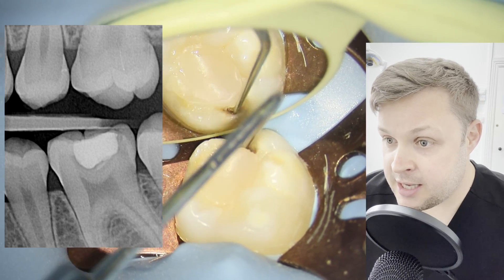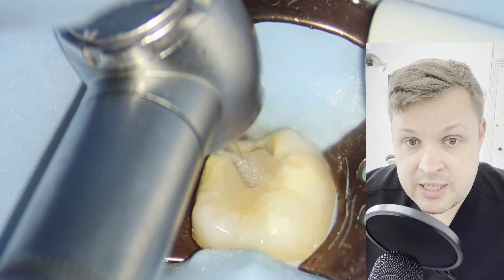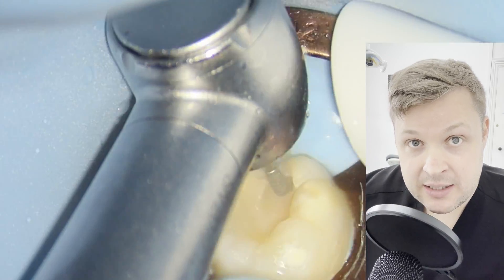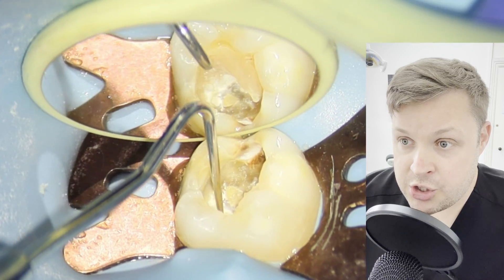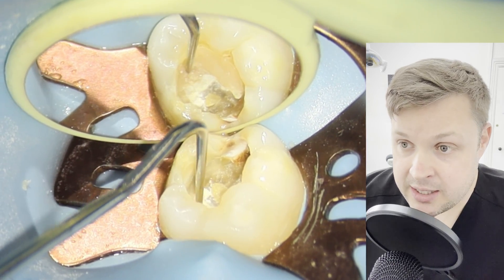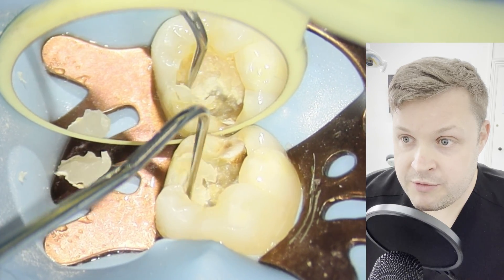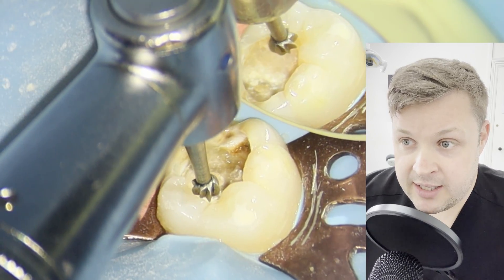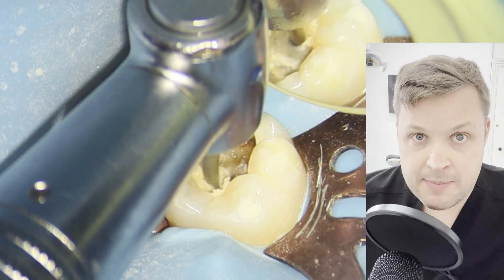Initially this was just going to be a routine filling — I wasn't expecting it to be deep at all, especially looking at the bite-wing radiograph. But as soon as I removed the composite filling that was in place, I immediately noticed that the dentine underneath was very severely decayed. As soon as I recognized this I knew I needed to be super careful, because I'm always thinking about the pulp.